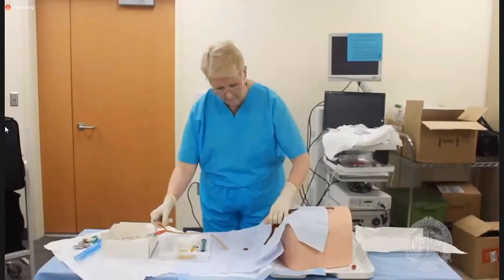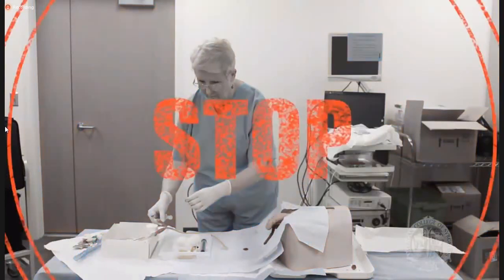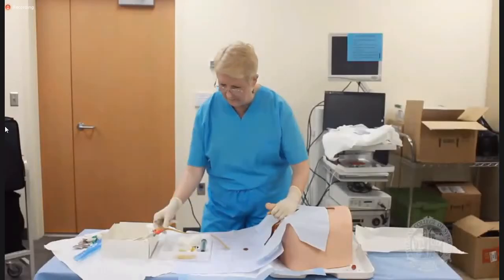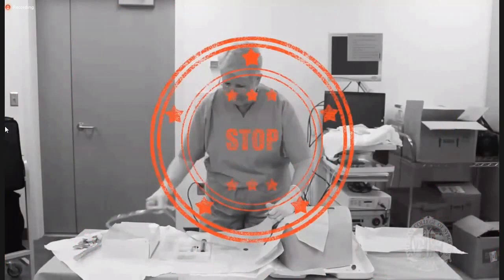Let's talk about errors and complications. By far the most common error is a break in sterile technique. Once your non-dominant hand touches the skin, it's contaminated and cannot touch any of the tubing or the catheter. Likewise, your dominant hand must stay sterile and not touch the penis or vulva or anything outside the sterile field.